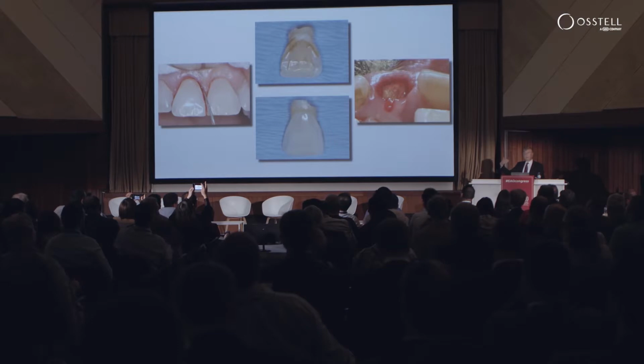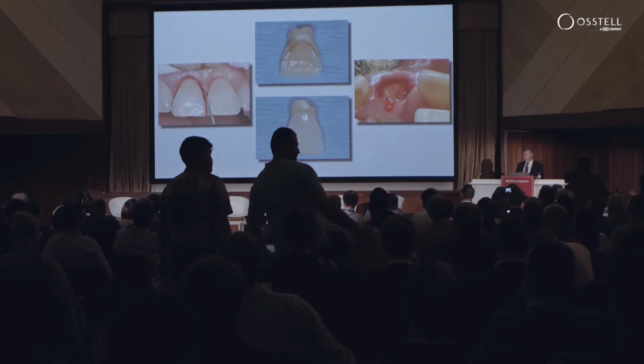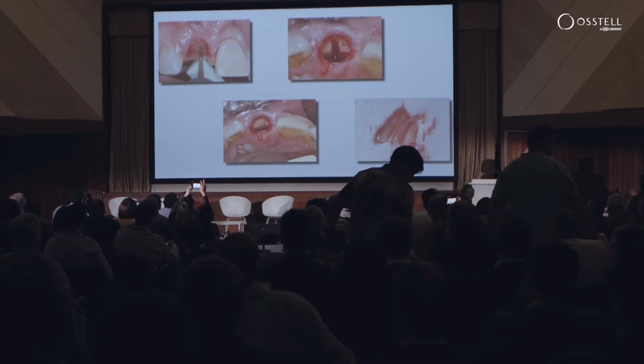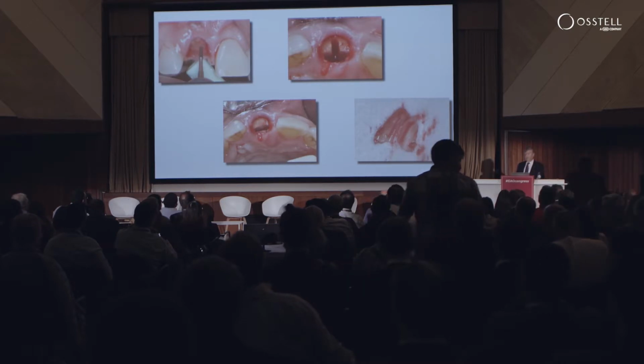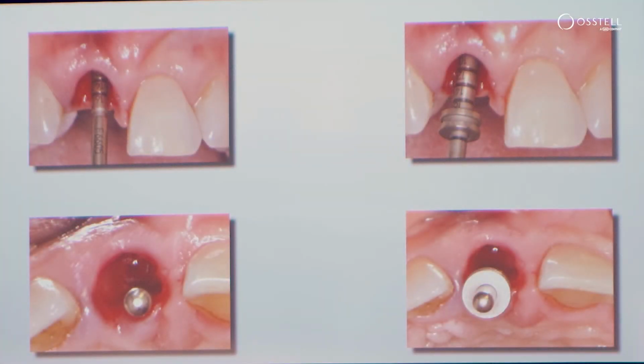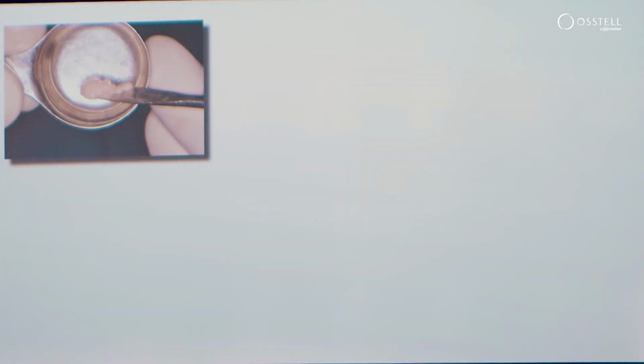So the first part of this is atraumatic tooth extraction, although I will tell you that any tooth that's extracted on me is going to be traumatic, so we try to minimize the trauma. And just take the tooth out without disturbing the socket as much as possible. The implants tend to be placed towards the palatal. We tend to use smaller diameter implants, so no larger than approximately 4 millimeters. You can see just the osteotomy being developed towards the palatal. We want to leave a buccal gap of 2 to 3 millimeters.